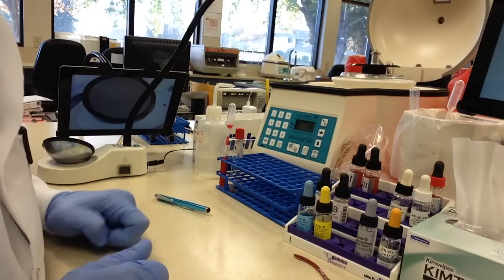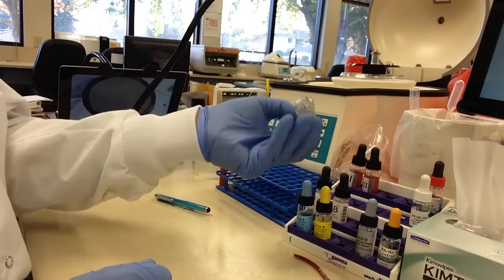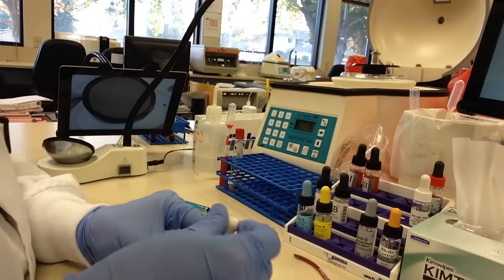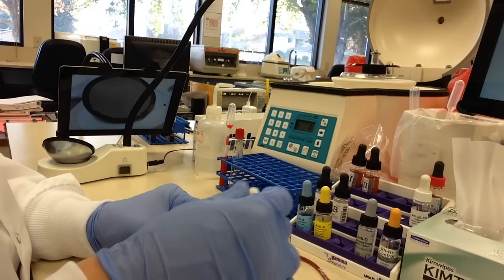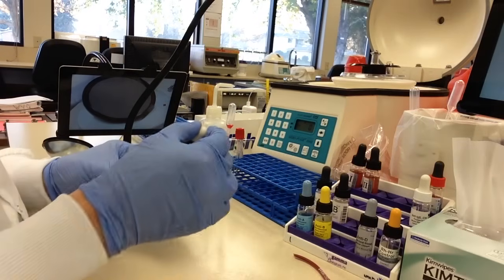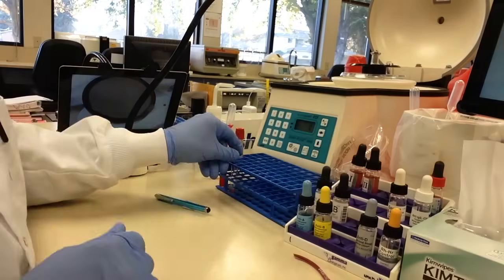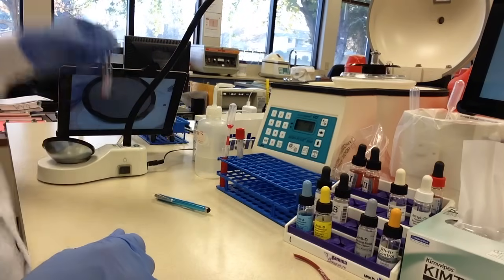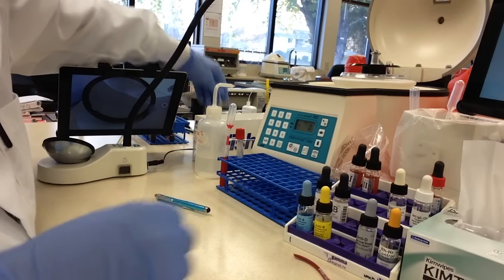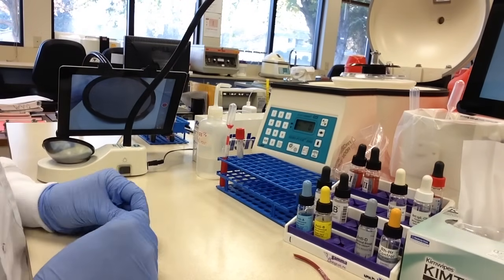We are going to be going on to the IAT phase. So that means we are going to add two drops of LISS. Mix slightly, and then that is going to go in the heating block for 15 minutes. Our 15 minutes have passed.